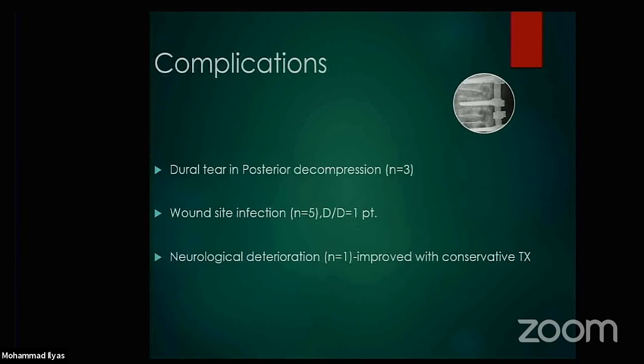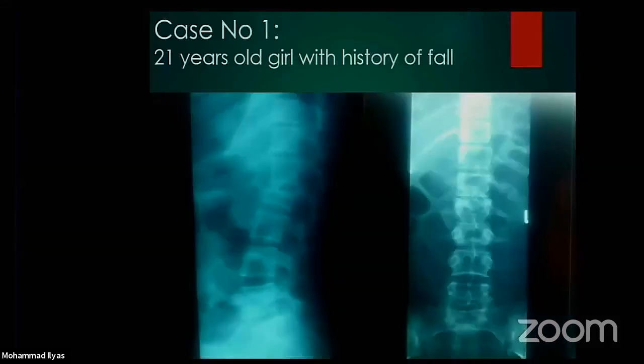Complications in our study: there was a dural tear while doing the posterior decompression in 3 patients, and in 5 patients there was wound site infection. One patient had debridement and wash, and there was neurological deterioration in one patient, which improved in a few days on conservative treatment.